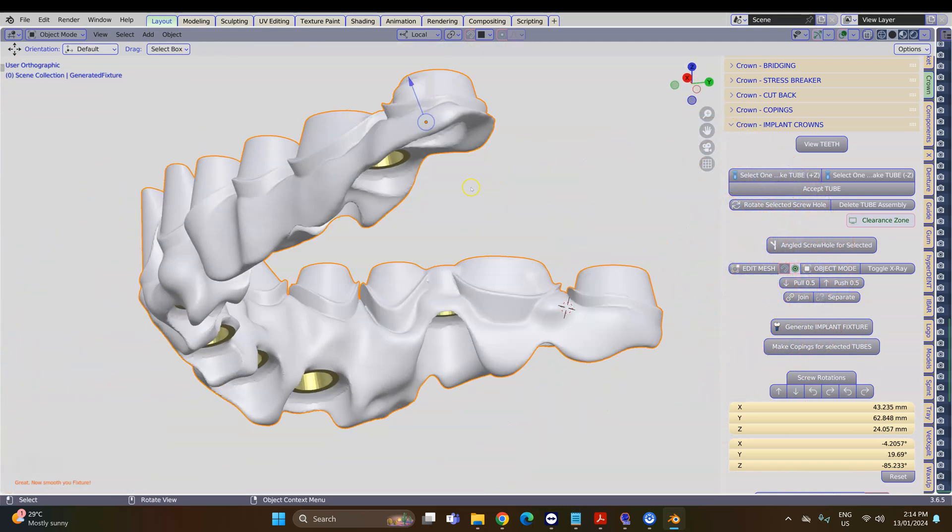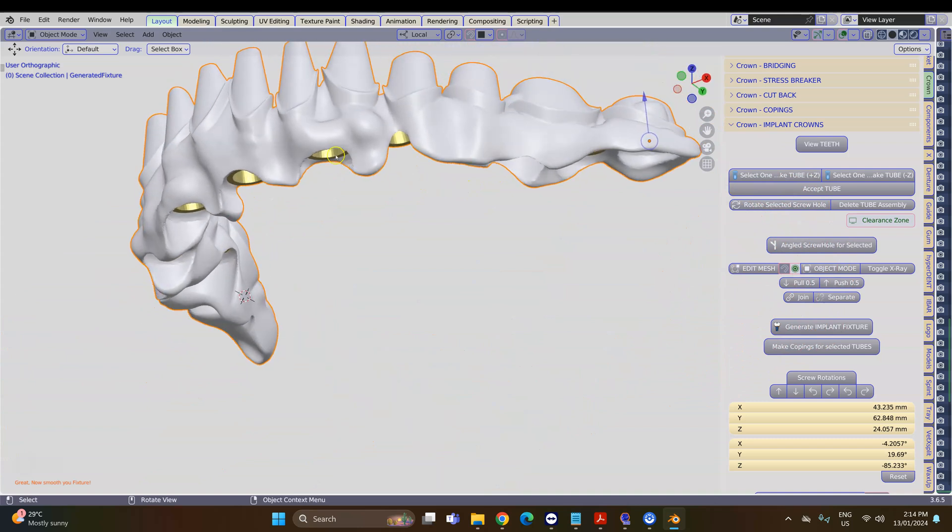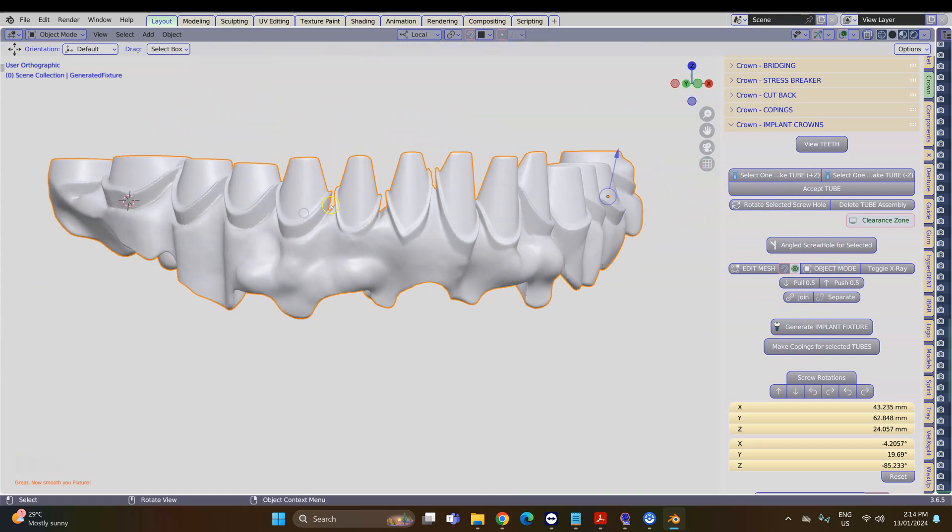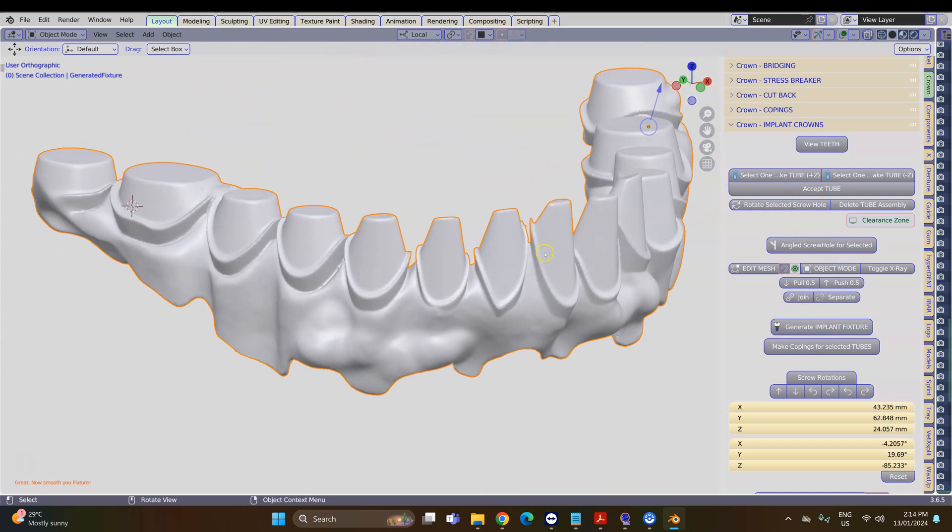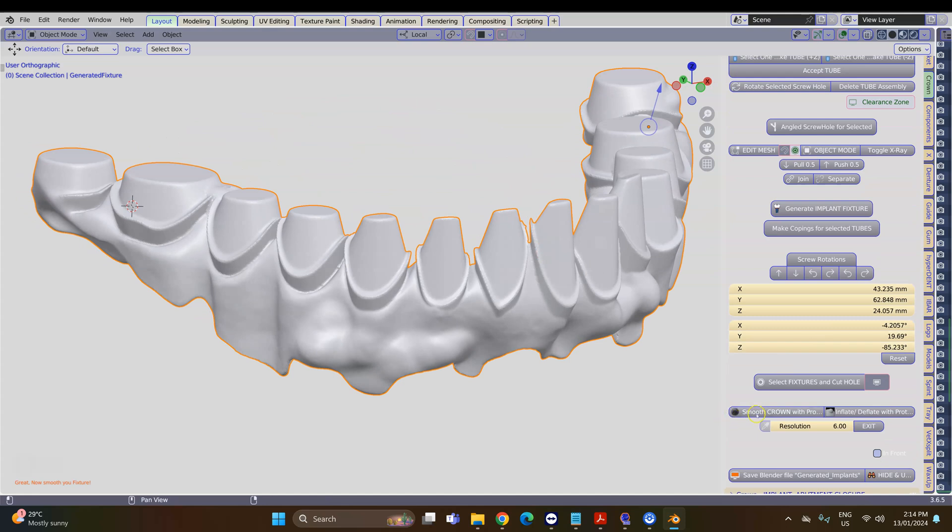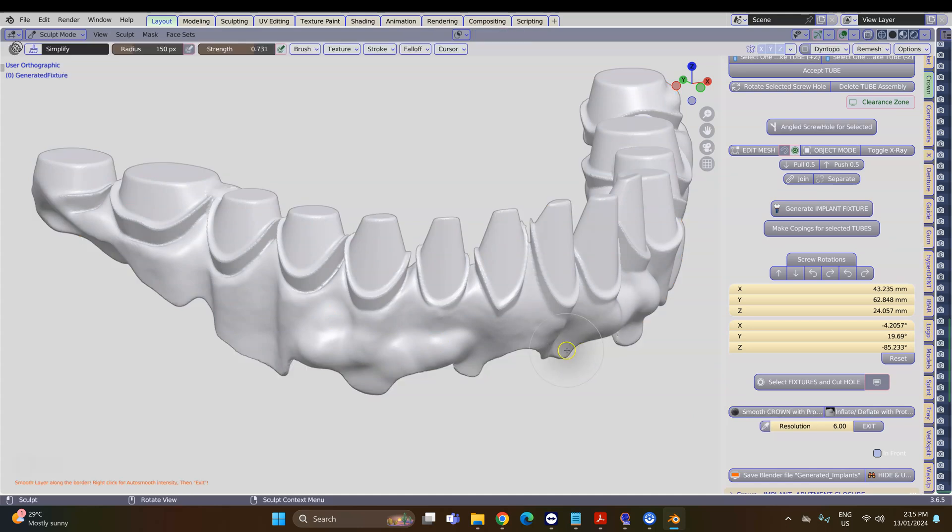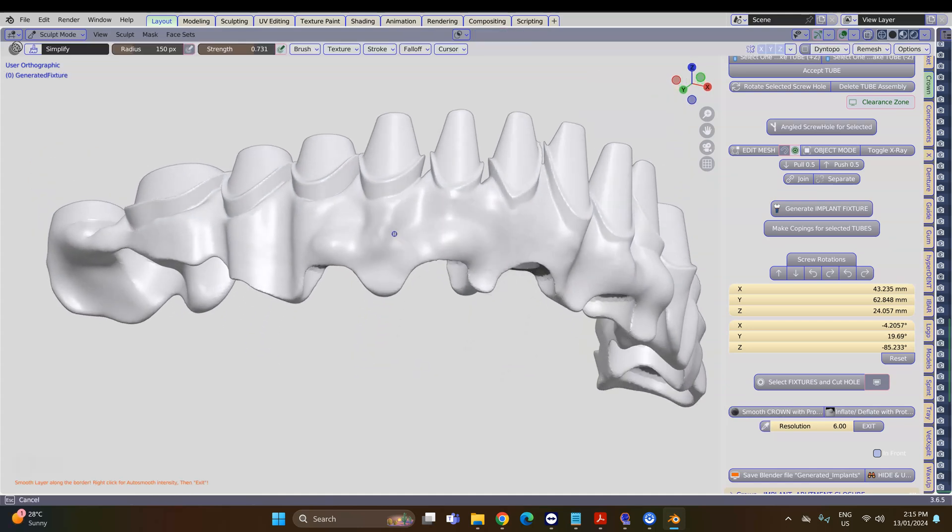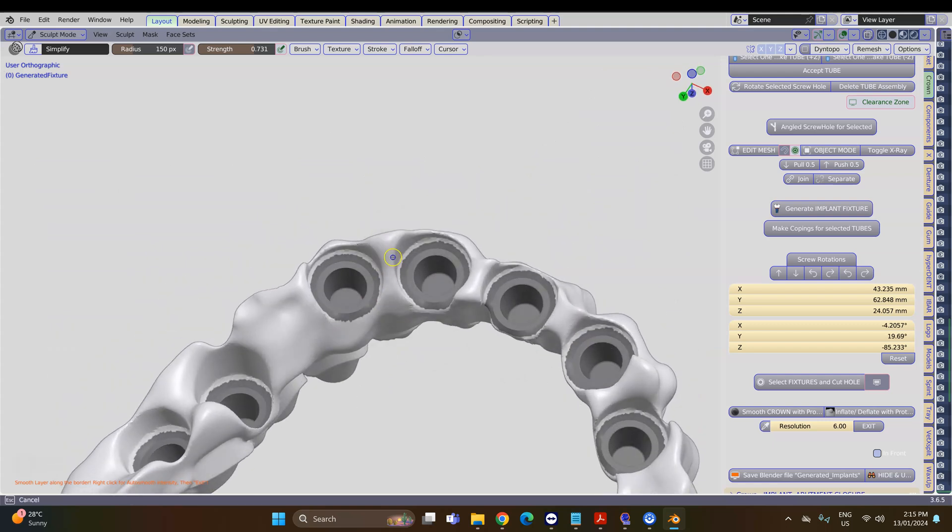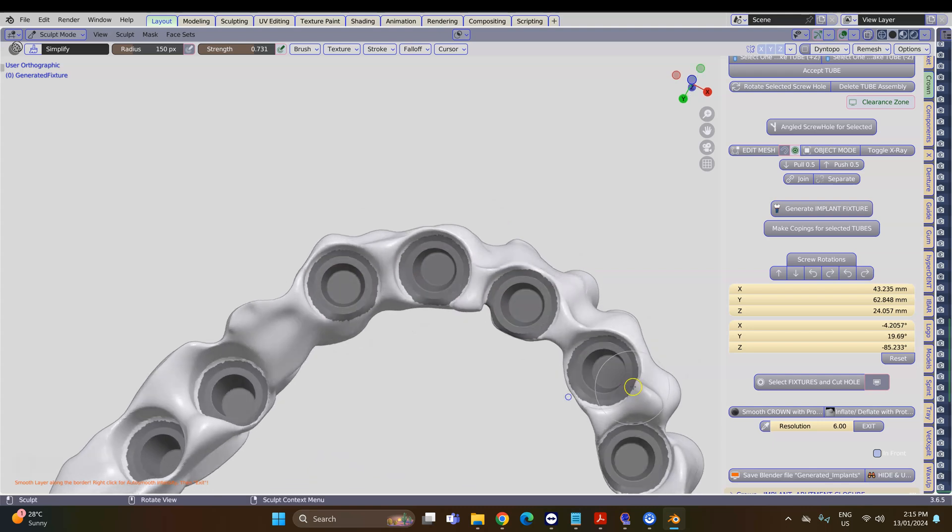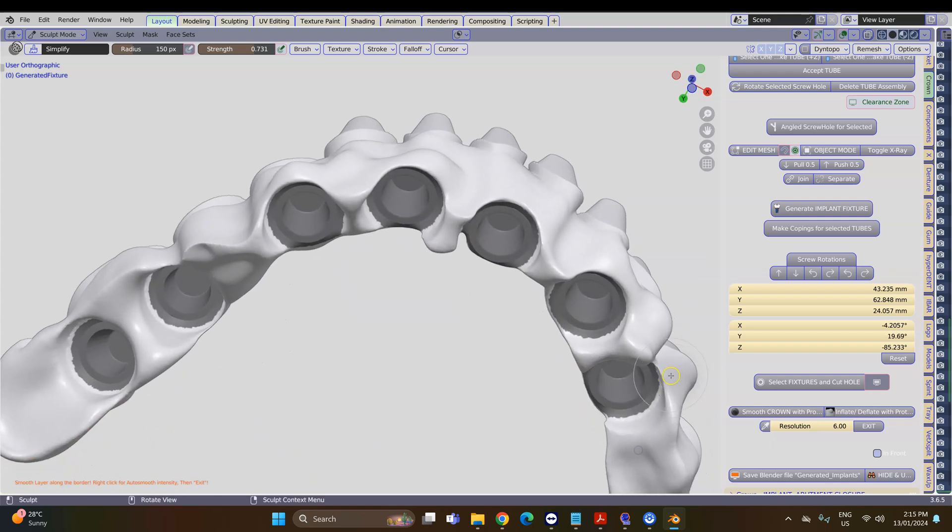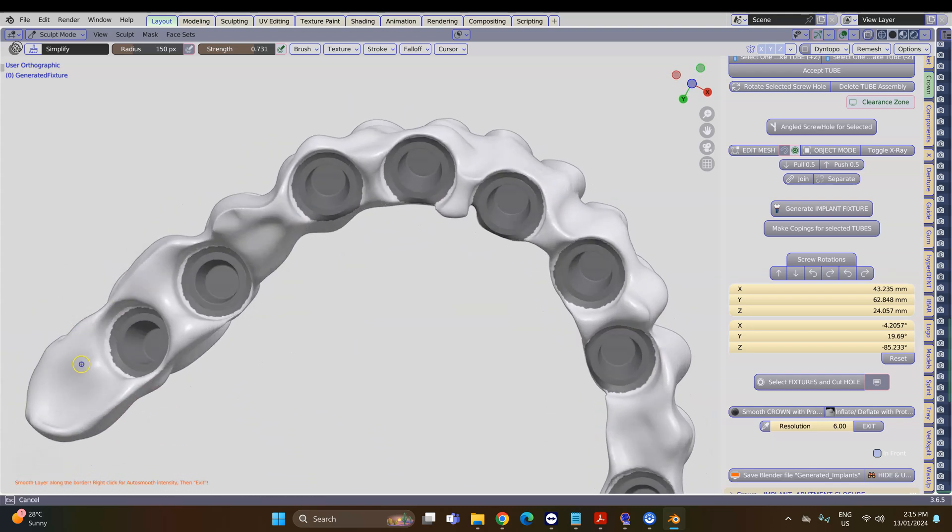This is what I'd like to see. Then finally we can smooth it one more time. Click on Smooth Crown with Protection and smooth it down. This is why it is very important to do the smoothing before you've connected them to the implants—it makes everything way simpler.